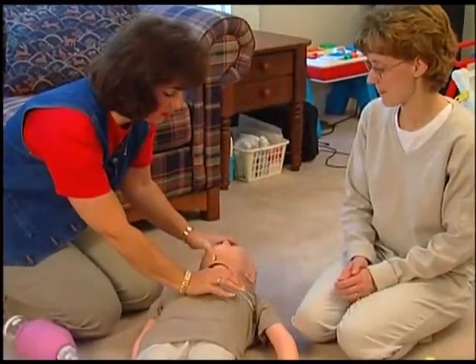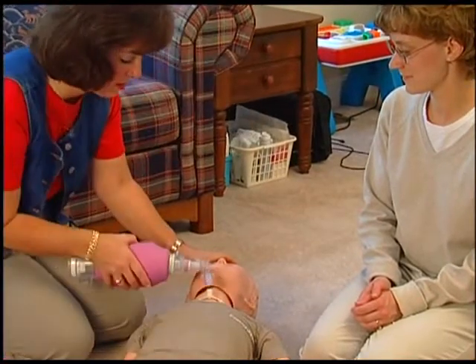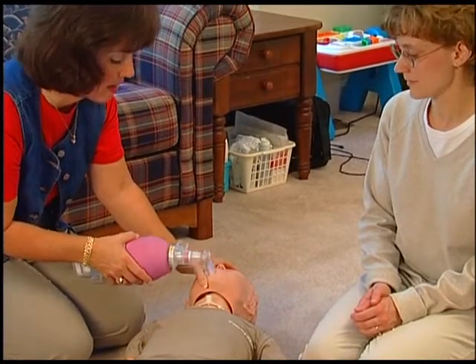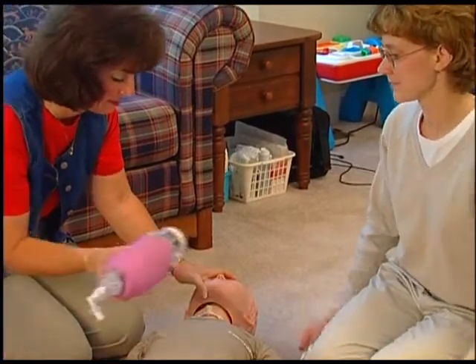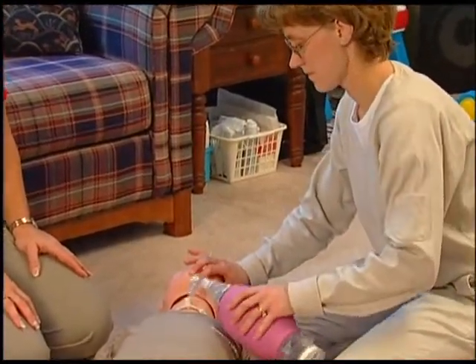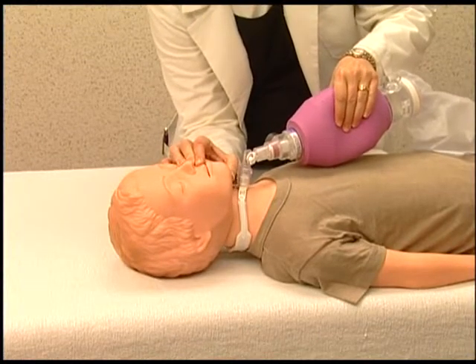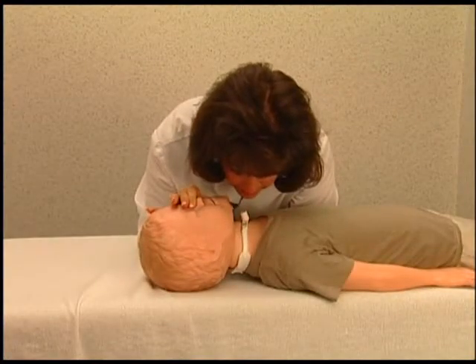It is strongly recommended that you receive training on infant or child cardiopulmonary resuscitation, CPR. This may be provided at the hospital, or your healthcare provider can give you information on where to take a class. There is a difference in CPR technique for a child with a tracheostomy. A child with a tracheostomy will need rescue breathing, or breaths, through the trach rather than through the mouth. To do this, you will need to close the child's mouth and give breaths through the tracheostomy tube using a resuscitation bag, or mouth-to-trach technique if a resuscitation bag is unavailable.